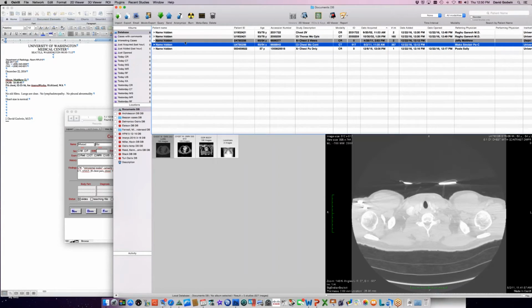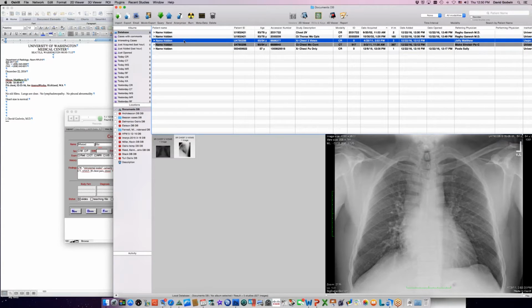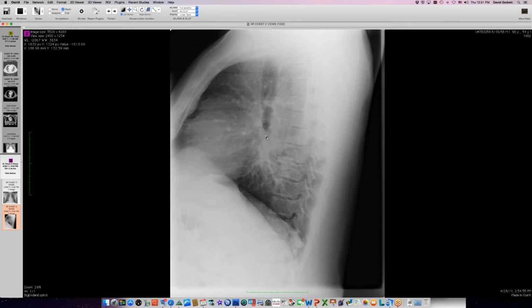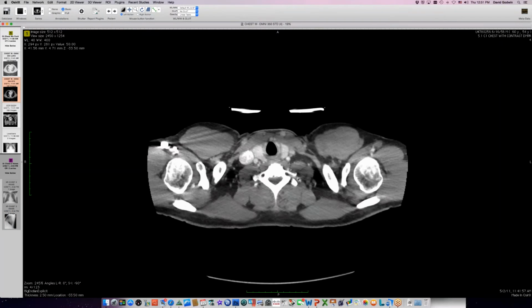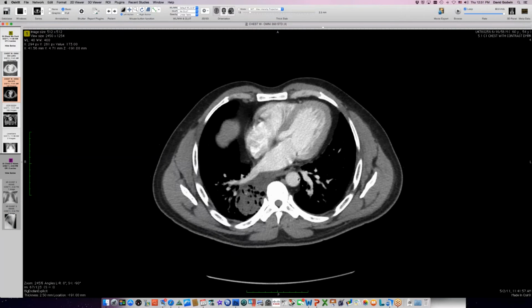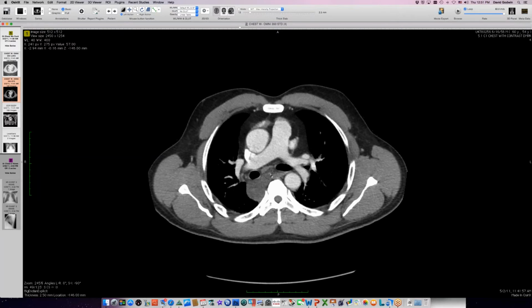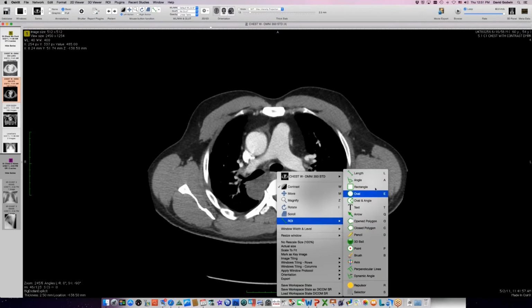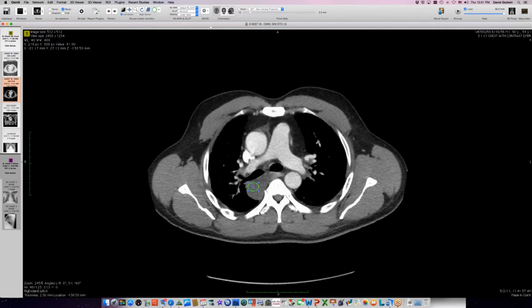Okay. So then I'd like to show you a case of congenital heart disease or congenial heart disease, depending on how well disposed you are to it. So this person has a fairly normal looking radiograph, except on lateral view there's fullness back here, and on CT it turns out that there is a cystic abnormality, which is kind of asymmetric and seems to be hanging out like this. And let's get some ROIs on it.